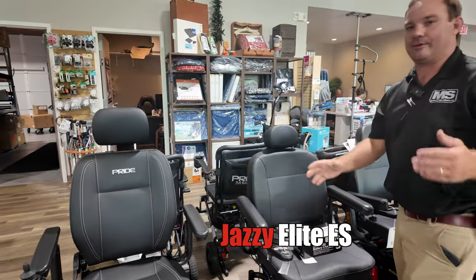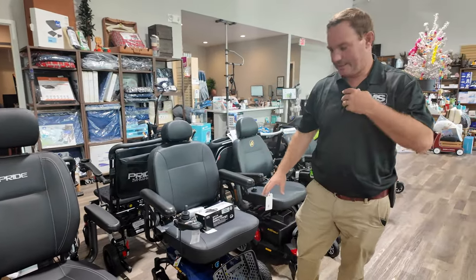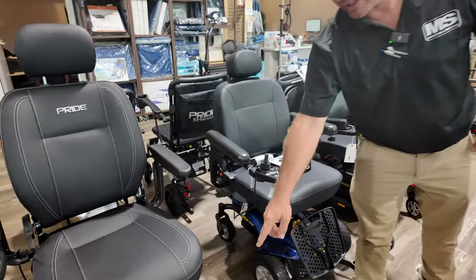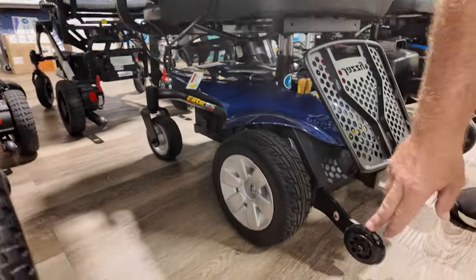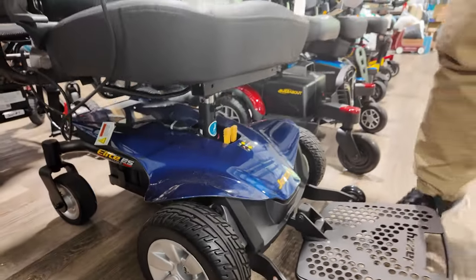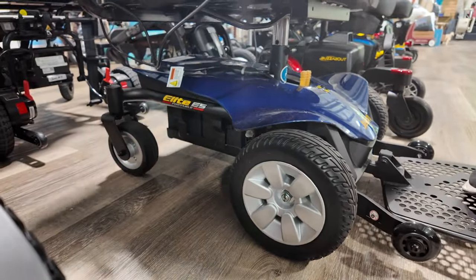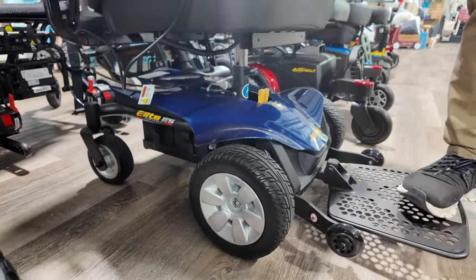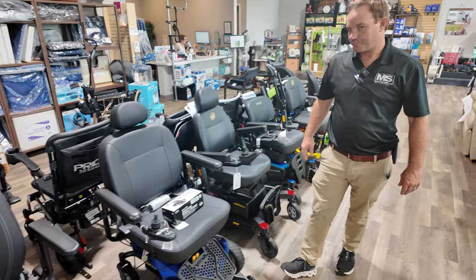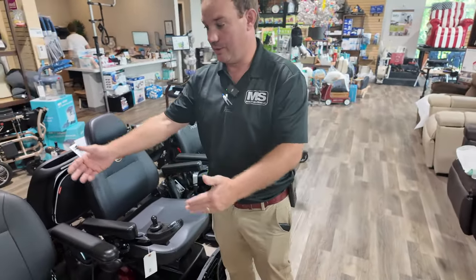Next is the Jazzy Elite — they have some different names for it. This is a very affordable chair. It's more front wheel drive, positioned a little more forward. You don't have the little casters at the front, just anti-tips. Be careful on steep ramps because you never want to step on the anti-tips. It leans forward a little more, so I probably wouldn't recommend a front wheel drive chair for steep hills. But it's nice — standard U1 batteries, all-day use, high back seat with recline.